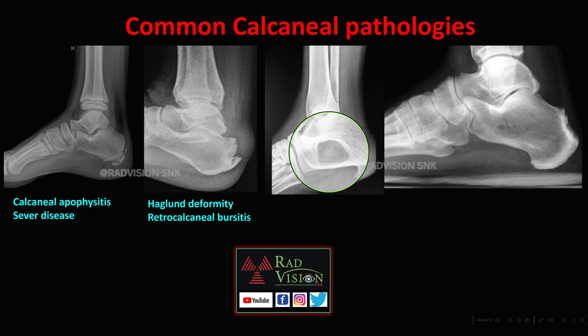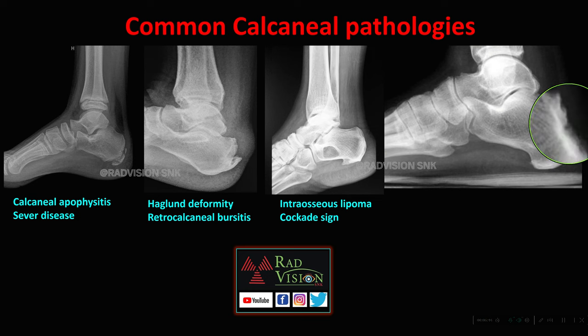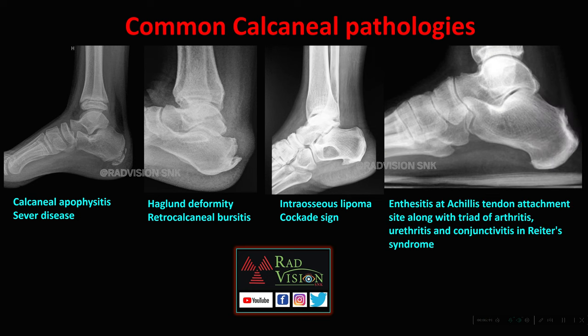A lytic lesion with sclerosis and a small nidus inside the calcaneum is classically seen in intraosseous lipoma — this is the Cockade sign. Erosions and irregularities at the level of the Achilles tendon attachment at the calcaneum represent enthesitis at the Achilles tendon attachment site. Along with the triad of arthritis, urethritis, and conjunctivitis, this is Reiter's syndrome — remember: can't climb, can't pee, can't see.